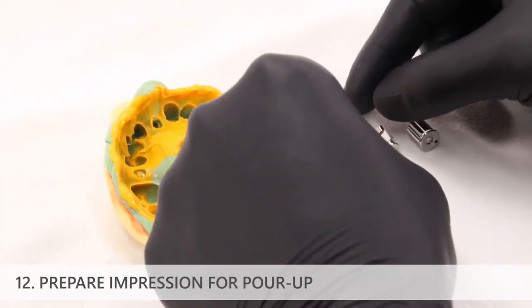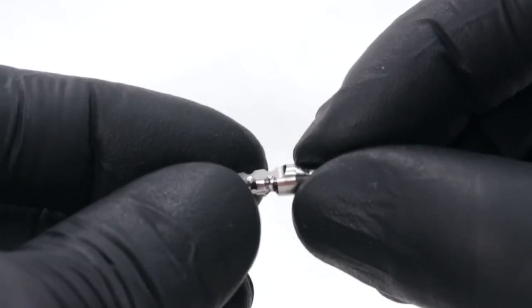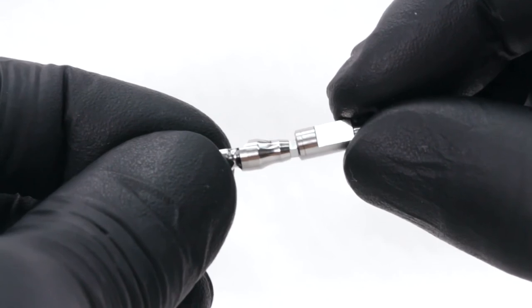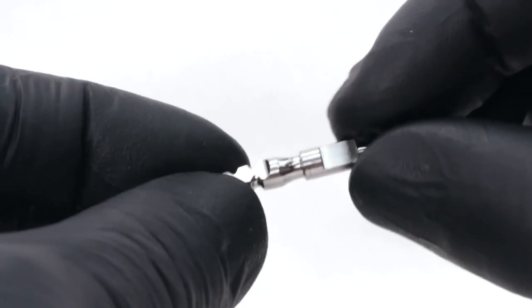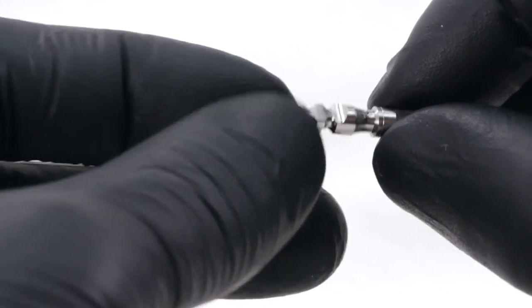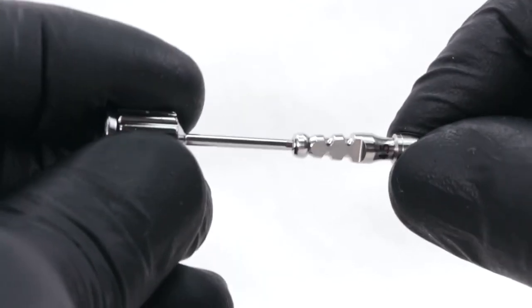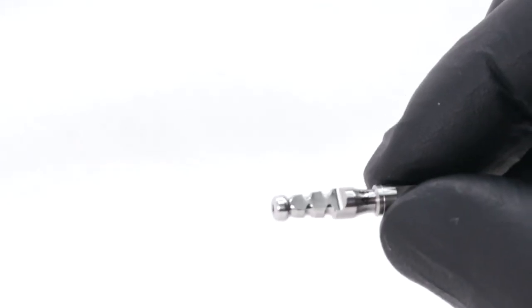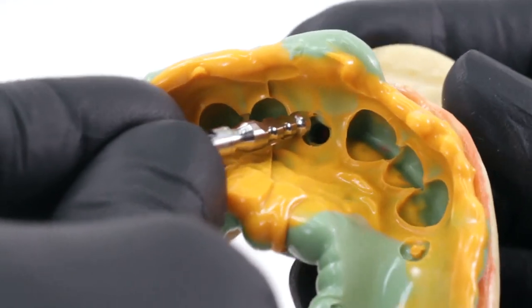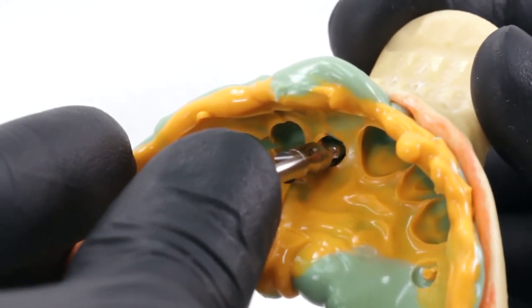Prepare the impression for pour-up. First, assemble the impression coping and implant analog: take the impression coping and insert an implant analog onto the indirect transfer impression coping. If using an impression coping with a hexed or engaging interface, rotate the implant analog slightly while inserting it to ensure that the analog drops into the hexed impression coping interface. Next, insert the impression coping screw through the access hole until it bottoms out in the analog and hand tighten with the prosthetic driver until it stops. Do not over-tighten or torque into place. Insert the impression coping analog assembly into the impression by pressing it firmly into place, aligning the flat face of the coping with the flat face of the impression material. It should snap into position when fully seated.